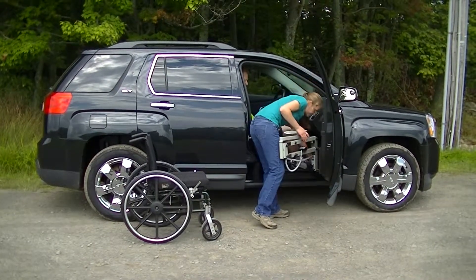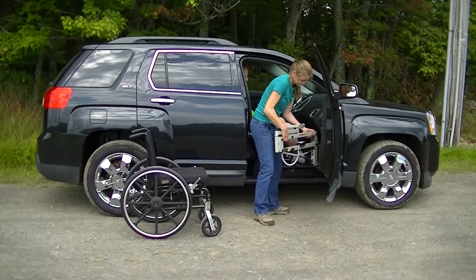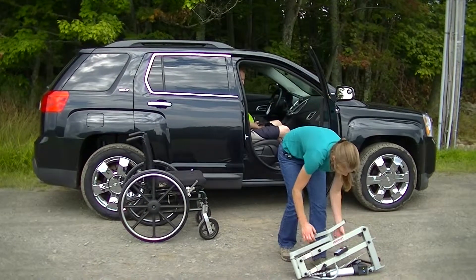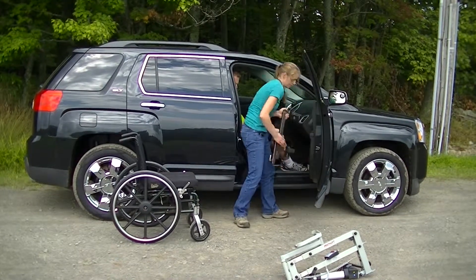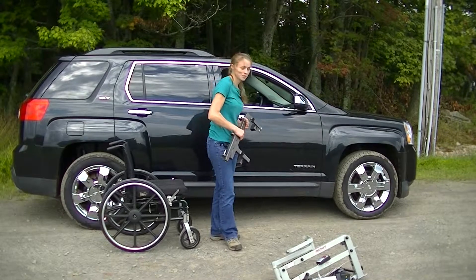Lower the multi-lift and disconnect the power. It just comes right back on. The speedy bar comes right back out the same way it came in, and he's ready to go.